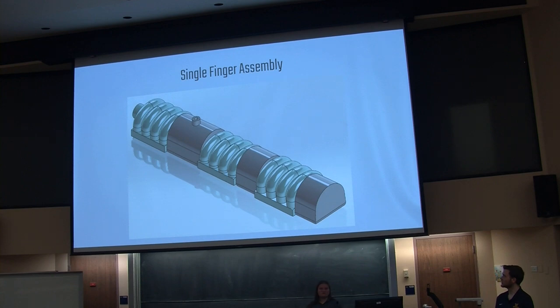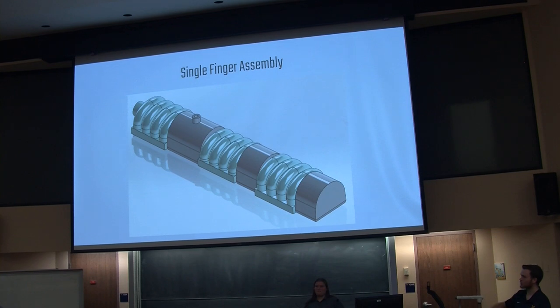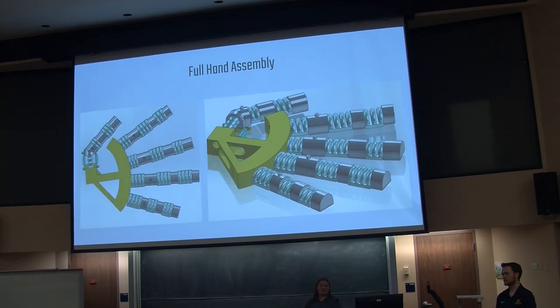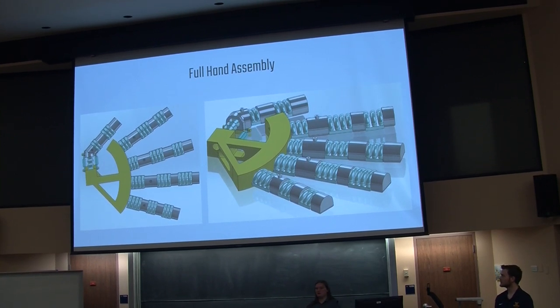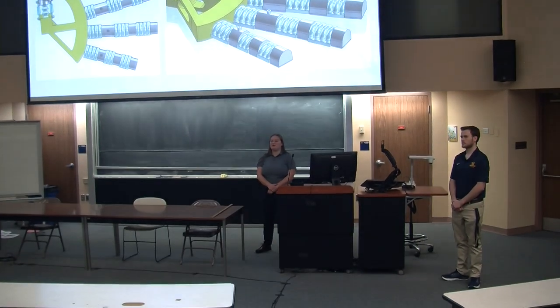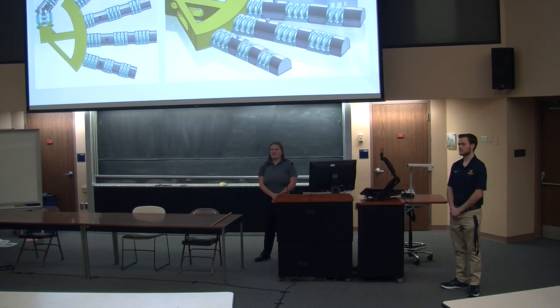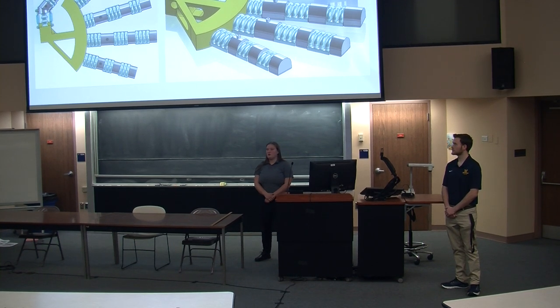This is a full assembly of our ring finger that we have put together. We do have a print of this, and as mentioned before, there are different variable dimensions between actuators — each actuator has a different height between the base and the curved portion of the rib. Here's our full hand assembly with each finger included. After looking at it and doing a little bit of simulation through SolidWorks, we came to the conclusion that we may need to decrease the angle between each finger. However, we're not entirely sure yet, as we haven't been able to print the entire hand — just one singular finger.